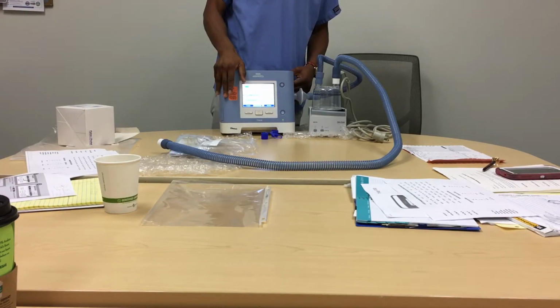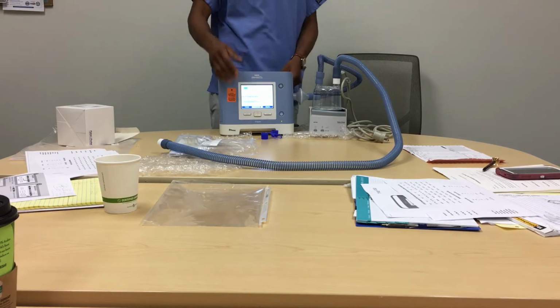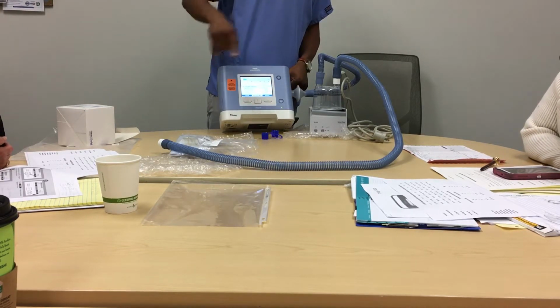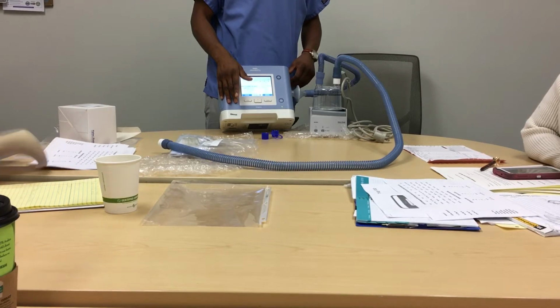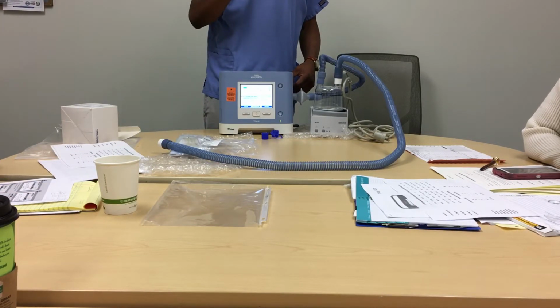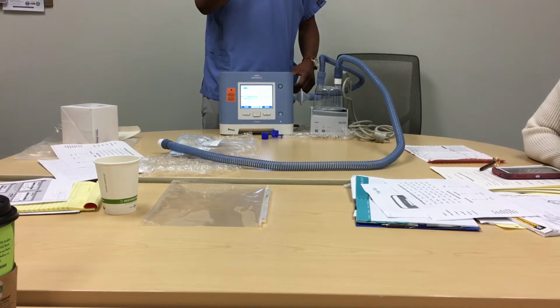But if they have an inline running neb, that will affect it too. Yeah, it's not going to sense it. Exactly, you have to turn the nebulizer treatment option on, and if you have it on and they are not on the neb, it will keep alarming too. So you have to adjust the trigger sensitivity in that case. So when you have a patient that you've locked out to that bare bone screen, can they still access the neb mode? If they are invasive, you just turn it on and leave it there. It should be fine. But initially, you have to adjust the sensitivity.